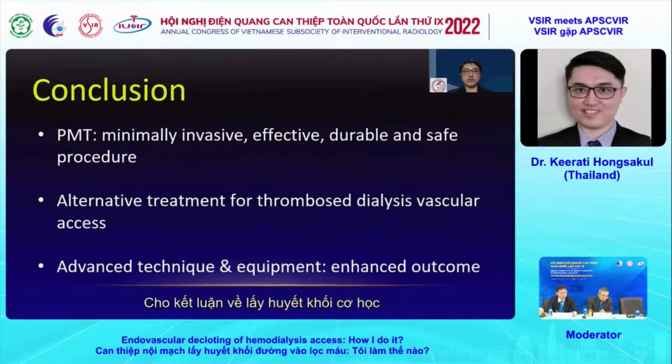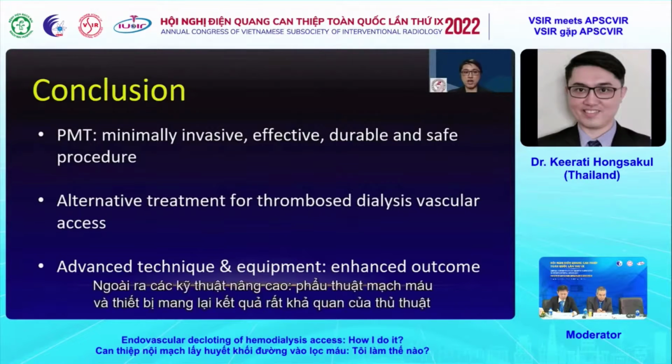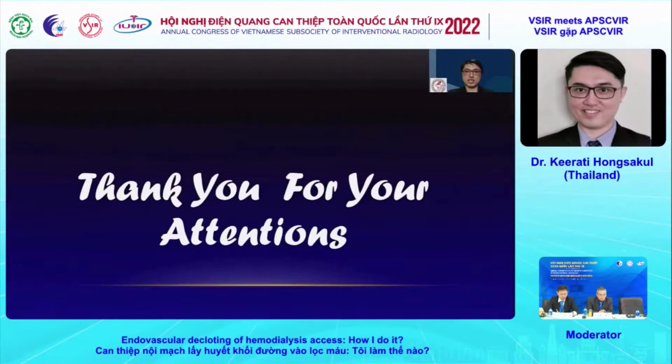In conclusion, pharmacomechanical thrombolysis is a minimally invasive technique and an effective, durable, and safe procedure. It can be an alternative treatment for thrombosed dialysis vascular access, including AVGs or AVFs. Advanced techniques, like mechanical thrombectomy and newer equipment, can usually enhance the outcome of the procedures. Thank you very much.